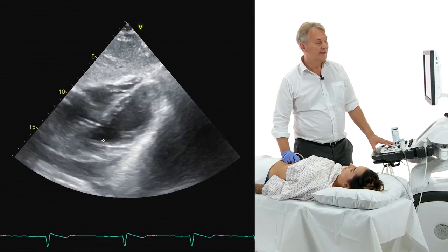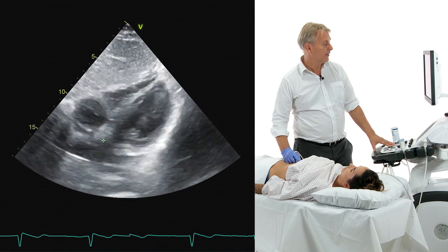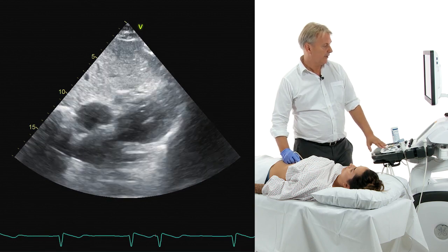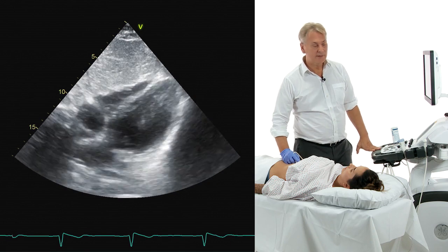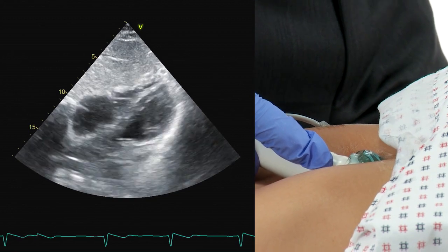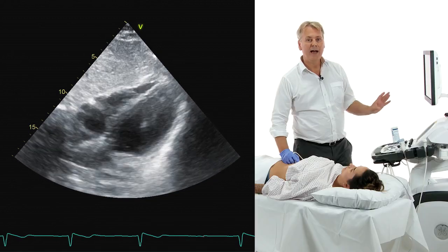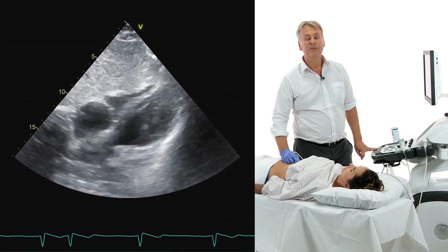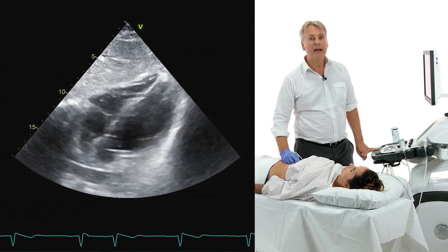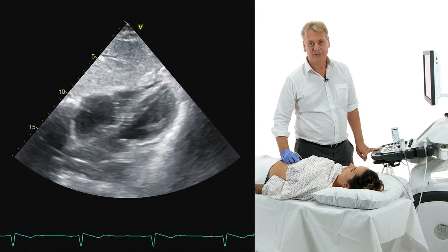The 4-chamber view is ideal to also image the interatrial septum. This is a structure which is very important if you're looking for atrial septal defects. And in the subcostal view, you have a perpendicular orientation to the defect. This is why the subcostal 4-chamber view is one of the most important views when you study atrial septal defects. But that will come in the chapter on congenital heart disease.